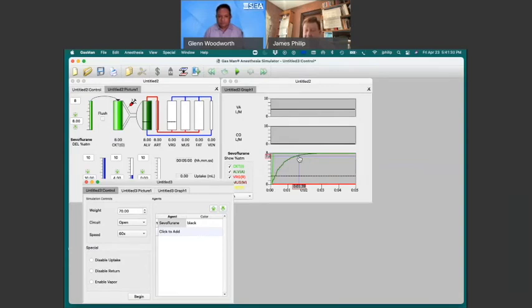And at the end of that hour and a half of holding the patient at 1 MAC, wake the patient up and look at the 3 simulations of those 3 anesthetics and see what you've learned about the time course of anesthetization first, and then the time course of wake up, and identify that the patients are different and that the timing difference is pretty much just what we see when we do these in real experiments. So that's how we've done it with residents.